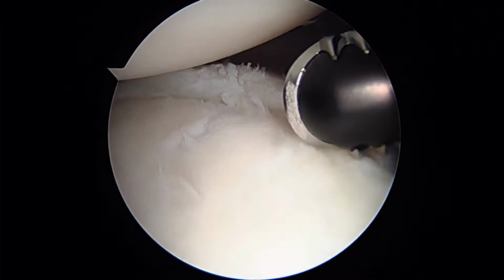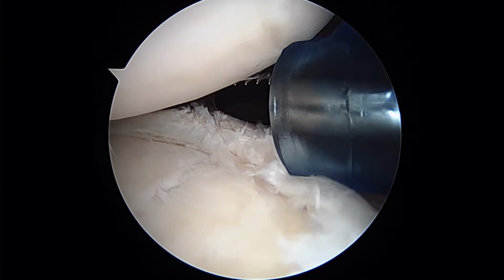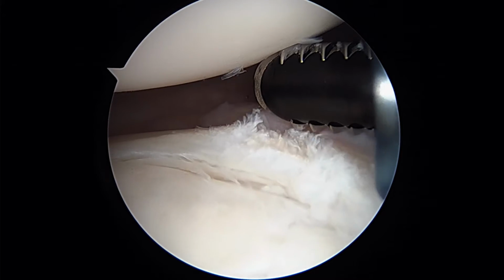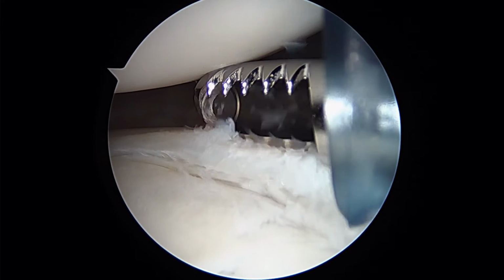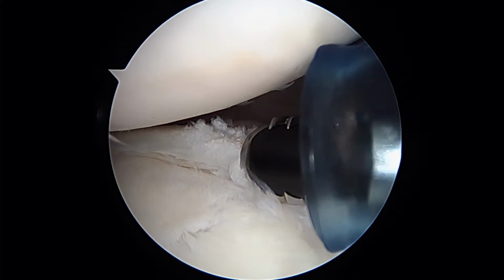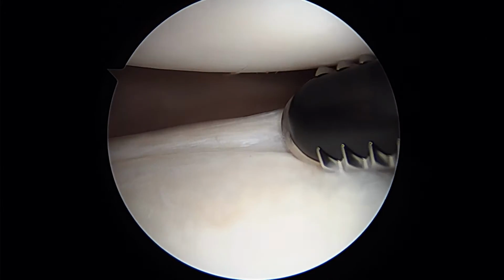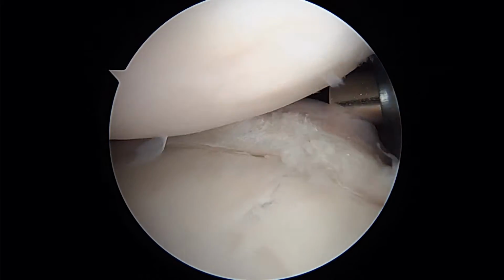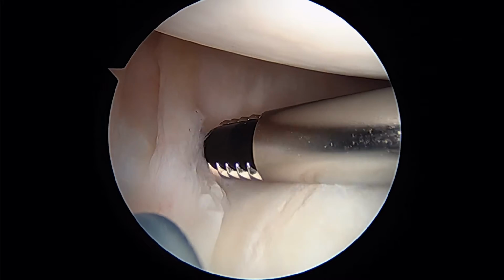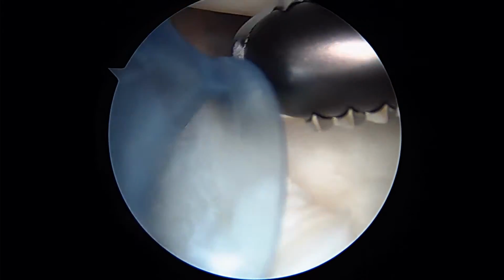The other thing that was really interesting is that your biceps tendon is already absent from inside the joint. We'll show you in just a second what I mean. But this is the posterior labrum. You can see how it's got a little split there and signs of ongoing damage. Our plan is to place a suture anchor down right about here and make some sutures in the posterior capsule, and then also to tighten up this anterior band of the inferior glenohumeral ligament to prevent that instability from happening.